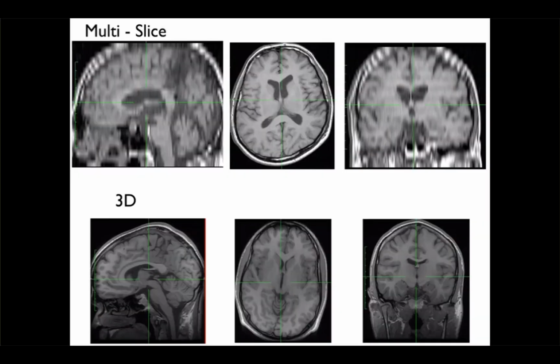All right. So here's actually just an illustration. This is an axial. So this was a 2D multi-slice acquisition that was acquired in the axial direction. And then I try to cover the entire brain by collecting more slices in a 2D fashion. This is a 3D scan.